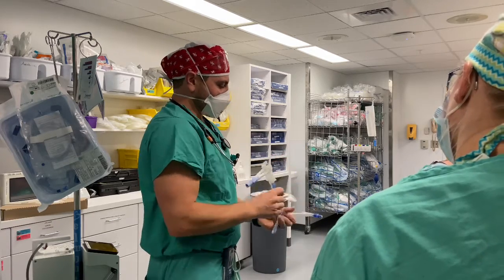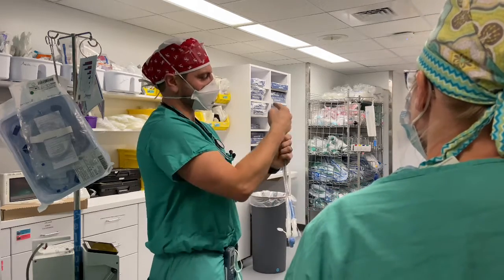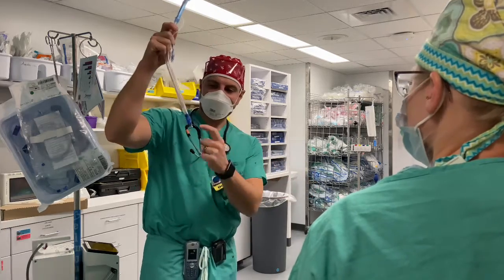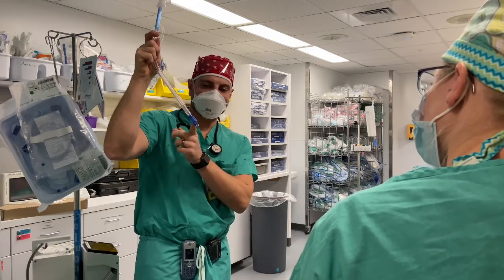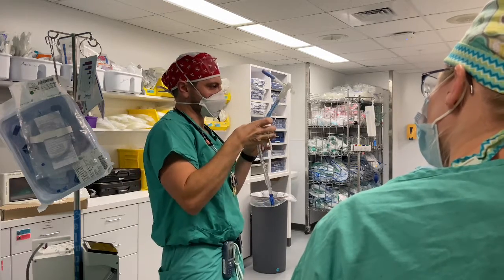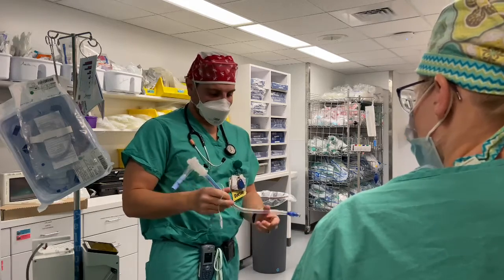Okay, you can see the right-sided balloon is a little bit different shape than a left-sided balloon. It comes off at sort of an angle with the intention of trying to allow more room below the balloon for the takeoff of the right upper, whereas the left-sided balloon is a little bit more uniform, sort of more oval as opposed to kind of off at an angle. Again, just so that you can continue ventilating that right upper lobe.